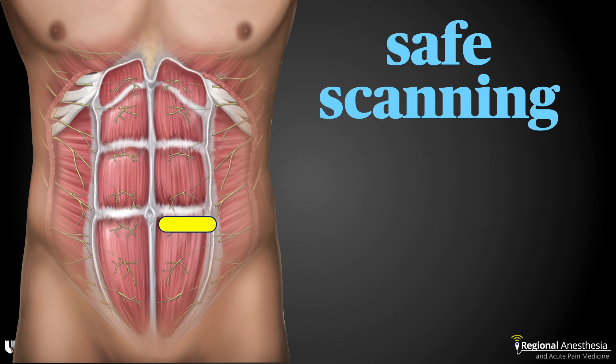Ensure that you can still visualize the posterior rectus sheath on the ultrasound image. We don't want to perform the block much below the umbilicus due to the absence of the posterior rectus sheath in that area.